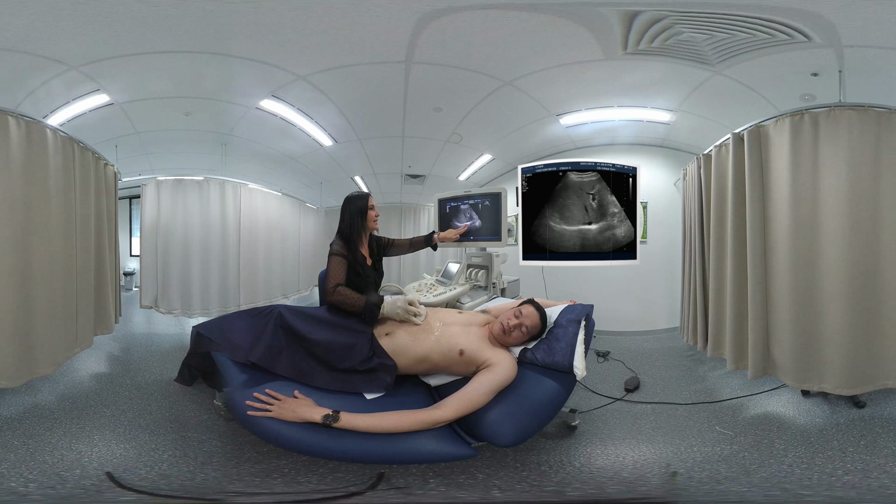So this is our diaphragm. Now this big bright thing that we're seeing here is our diaphragm. It's a specular reflector, and therefore our ultrasound waves, you can breathe away patient, will be coming down, hitting the specular reflector and reflecting back, and because it's a nice smooth surface, it will give us this nice line. So here we have our diaphragm, which is going up into our lung fields, and this is where we look for a fluid, particularly in cancer patients. So we're looking for diaphragmatic fluid and subcostal fluid there.